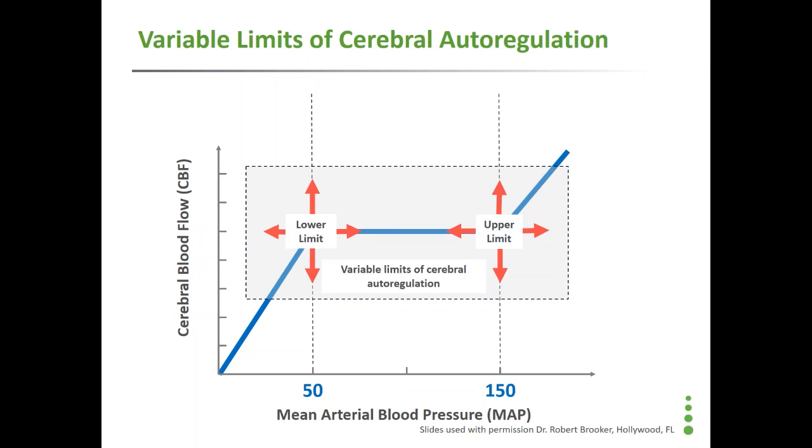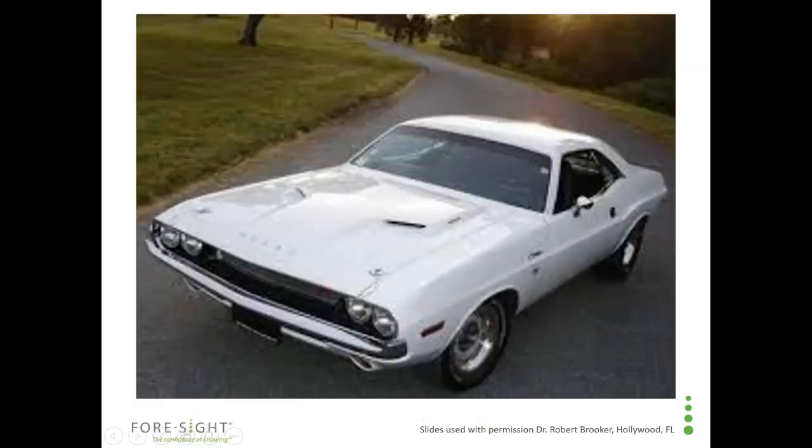And again, remember that during cardiac surgery, whether it's on bypass or off bypass, you have to decide what that number is, or somebody in the room is deciding what that number is because you're managing the patient. You're controlling the blood pressure. You're controlling the cardiac output. And you or someone on your team is controlling what the hemoglobin level is. So these are all variables that one way or the other we have to make a decision about with every case. And again, the important point is the variability here and not being able to reliably predict what that number is.